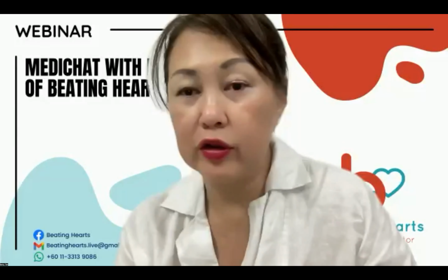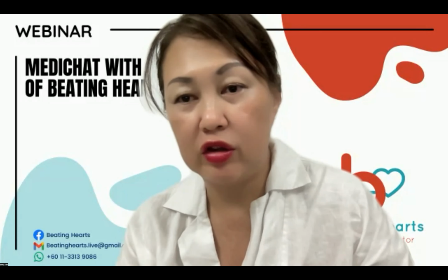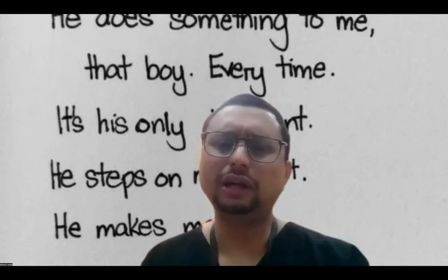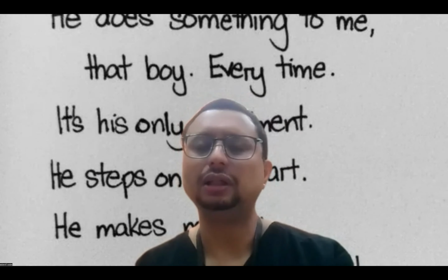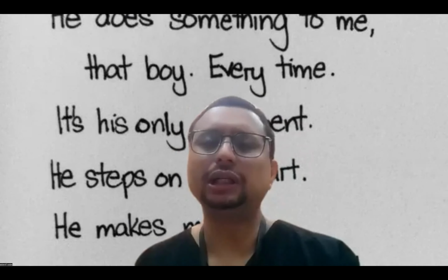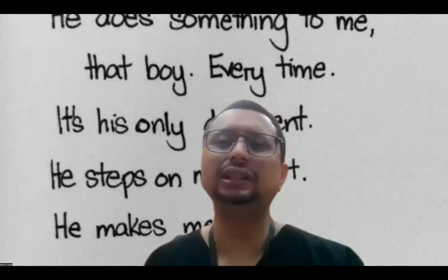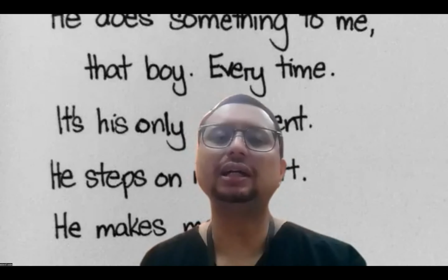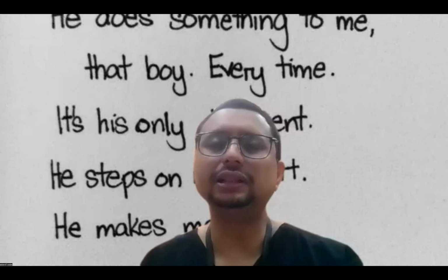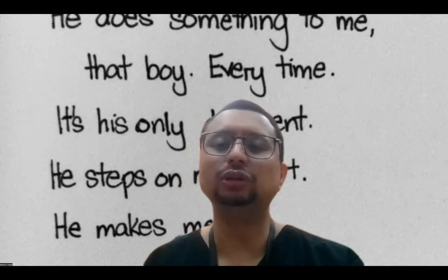Okay. Dr. Susie asked, could you elaborate the role of echocardiography in the early detection and monitoring of heart disease, especially with patients with risk factor or genetic predisposition? So definitely, like I said before, you use ejection fraction to detect left ventricular dysfunction. I give an example. If you are thinking about chemotherapy-induced cardiomyopathy, you actually can use echocardiogram to monitor the chemotoxicity to the heart. So one thing you can do is that you can do echocardiogram every 3 months and see whether there's any reduction in the ejection fraction. If there's any reduction in ejection fraction, you can actually start to institute anti-failure therapy or try to modify the chemotherapy regime.